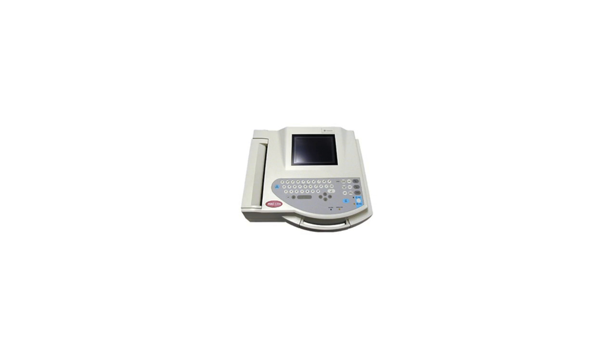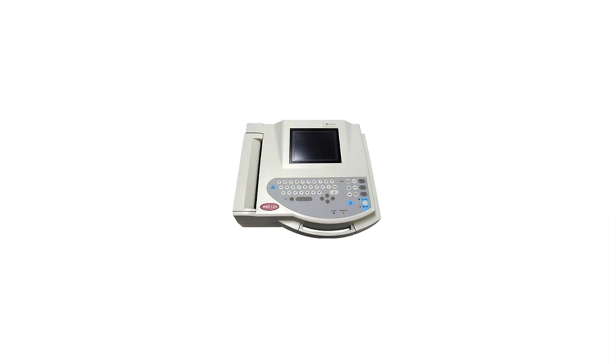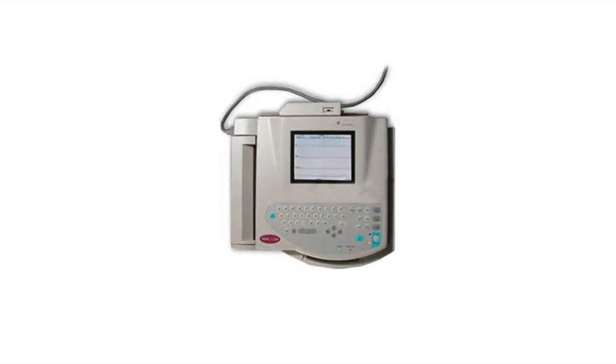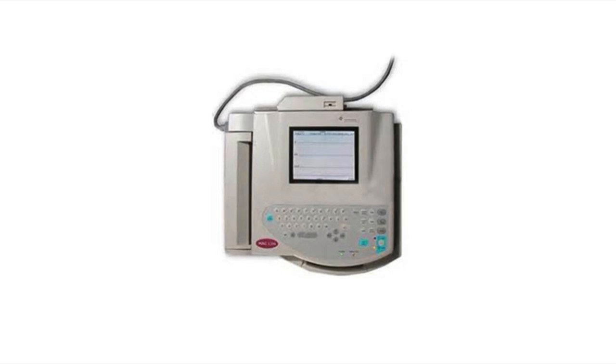The GE MAC 1200 Resting EKG is a comprehensive system with practical features. It is a compact 12-lead electrocardiograph designed for acquisition with or without analysis. This system can be configured as a standard EKG machine without analysis for facilities with minimal EKG requirements.